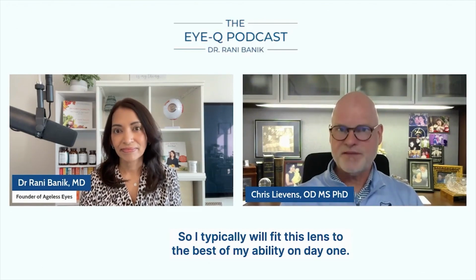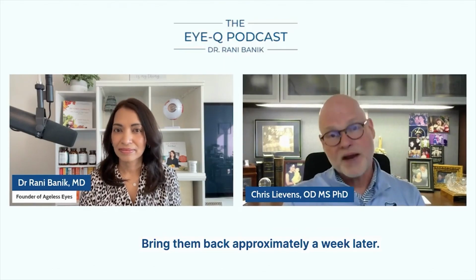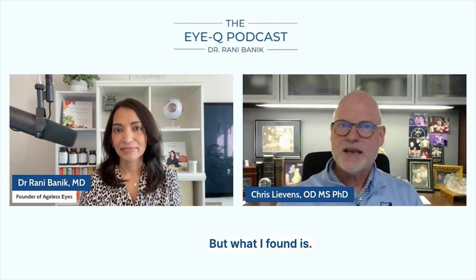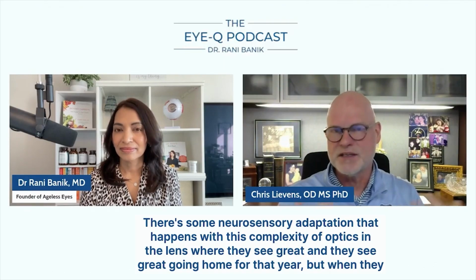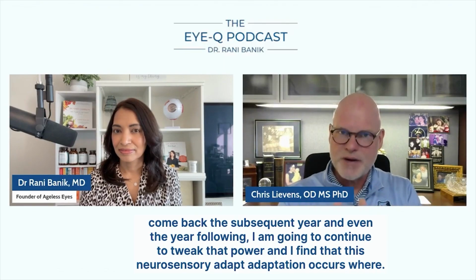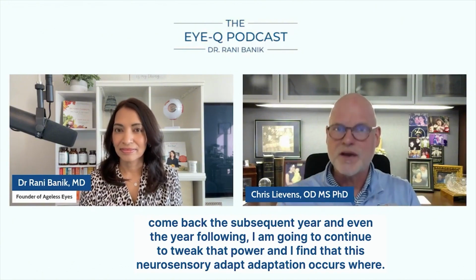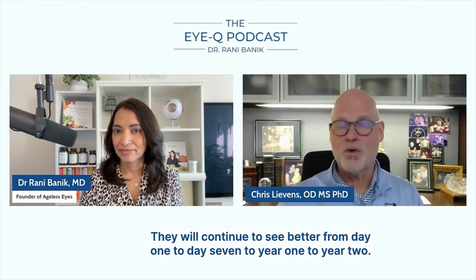So I typically will fit this lens to the best of my ability on day one, bring them back approximately a week later because I'll need to refine it a little bit. But what I found is there's some neurosensory adaptation that happens with this complexity of optics in the lens where they see great and they see great going home for that year. But when they come back the subsequent year and even the year following, I am going to continue to tweak that power. And I find that this neurosensory adaptation occurs where they will continue to see better from day 1 to day 7 to year 1 to year 2.